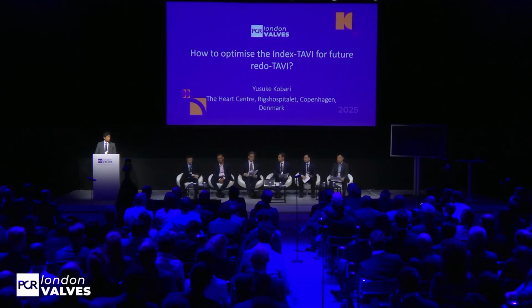So there are many considerations to make a good decision for the first valve. I think for this kind of case, I would prefer to avoid too high leaflets, because in the future, the second, third valve may have difficulty. So I would definitely choose an intra-annular valve. So this would be my first starting point. And secondly, I would choose an intra-annular valve with very good hemodynamics, because we know hemodynamics could also translate into durability. So this is my approach. So lifetime management and durability is also quite important. So Yusuke, please continue your presentation.